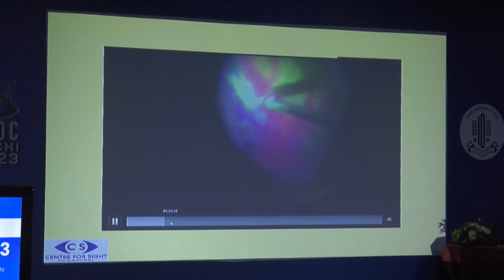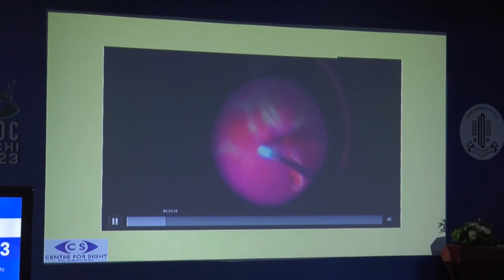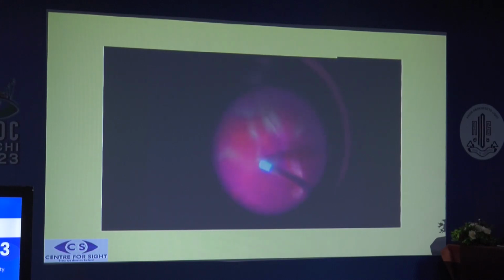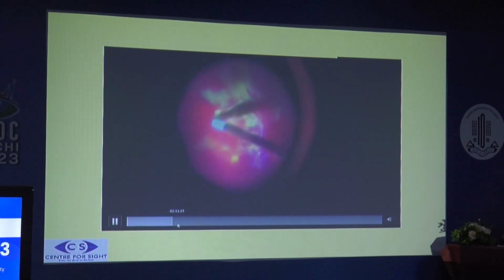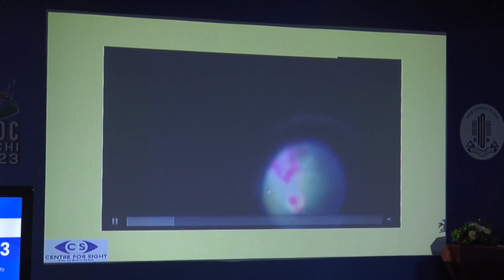And believe me, no two diabetic vitrectomies are the same. So much blood has come on during vitrectomy. This is an iatrogenic issue, and remove this with the help of suction mode only, and after that pay attention to the rest of the membranes. Like in this patient, just adjacent to the disc, we could identify one. Do not pull too much.